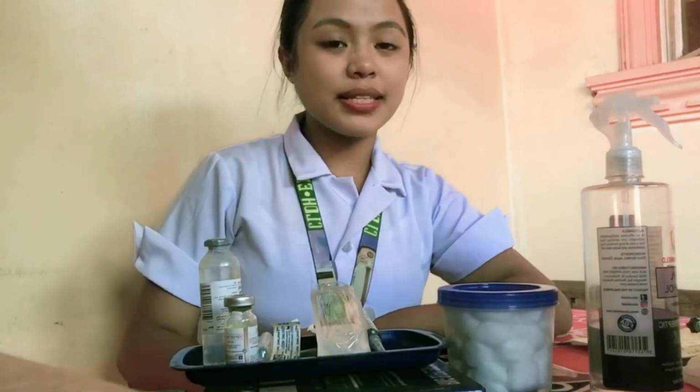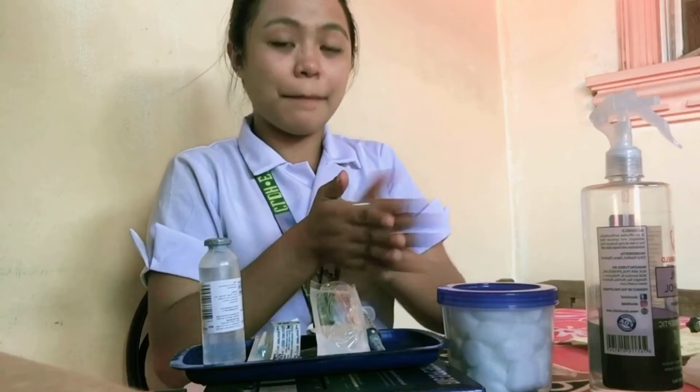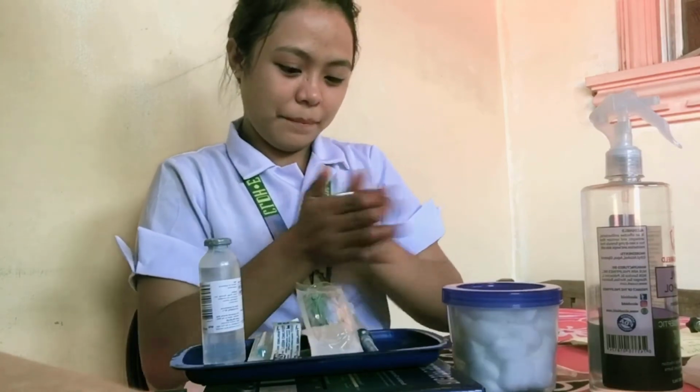After adding the sterile water to the powder vial, we need to mix our vial. The right way of mixing our vial is not shaking it. The right way is the rotational method or rotational pattern, because if we shake it, it can accumulate.